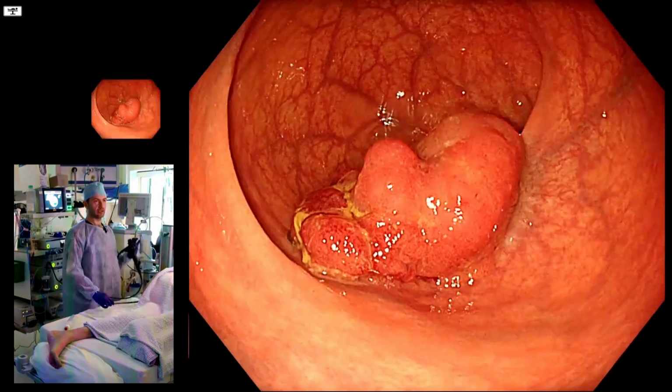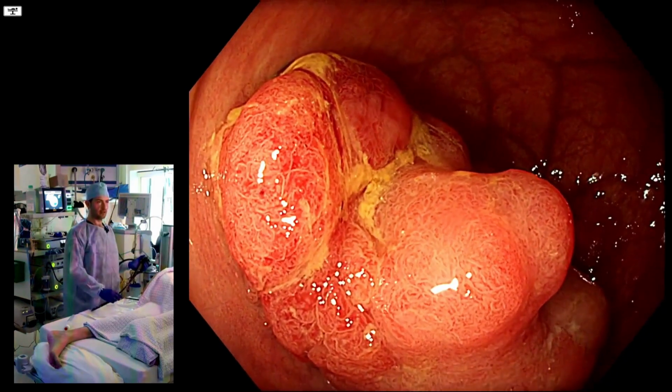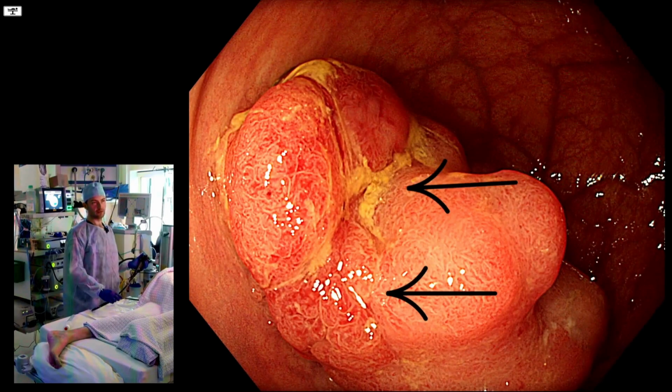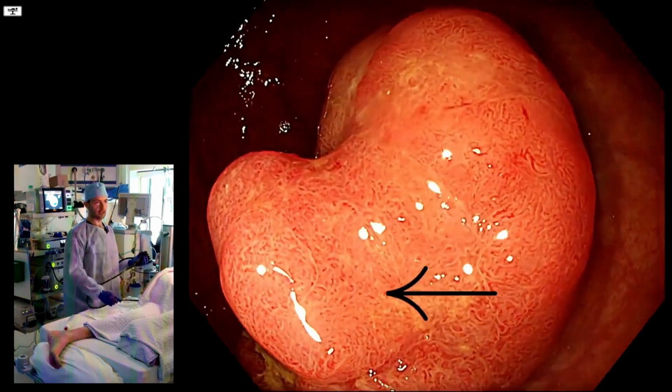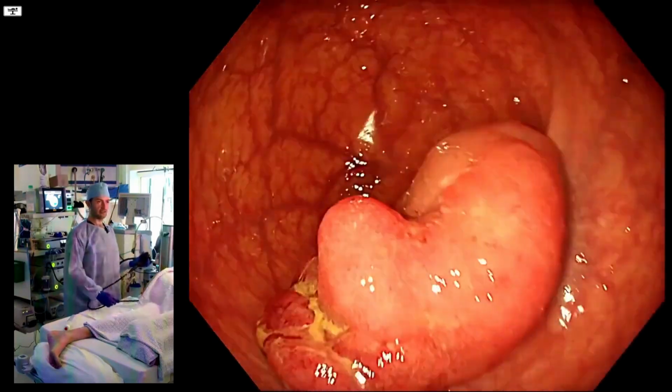Let's go up closer and have a look. So when we spend time looking around, you have quite a clear demarcation line between the left side of the image here and the middle of the image, something for us to look at a little bit more in detail shortly. And then we see it disappears over a fold.